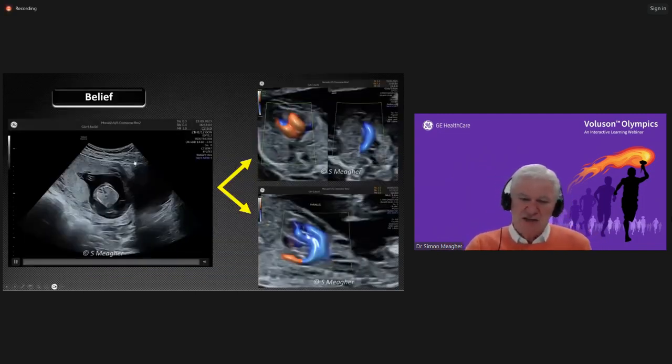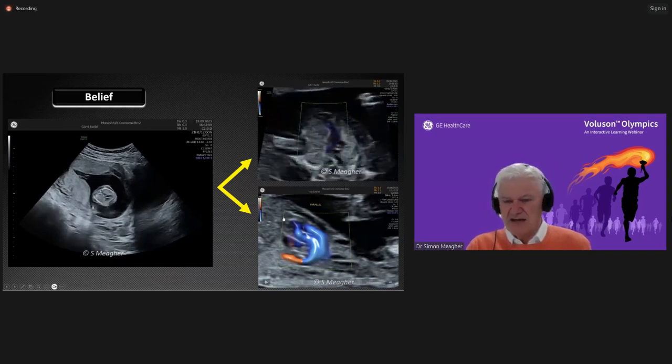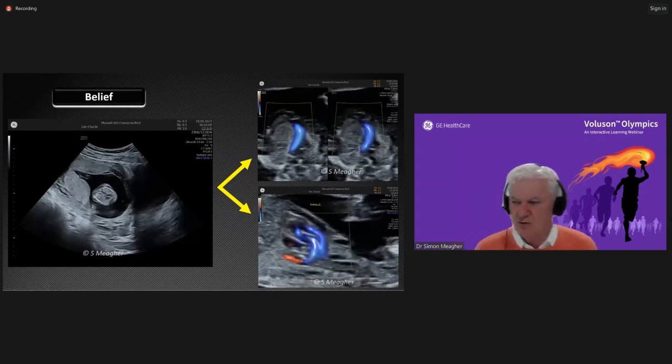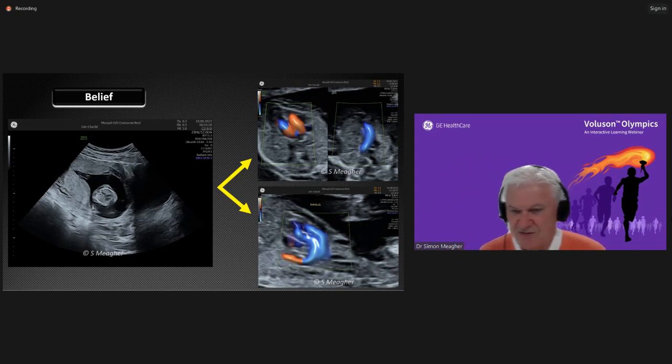So this is where we started. We started with an absolutely lousy image in a baby in a terrible position, and we ended up with a split image showing a 4-chamber view of the heart and a 3-vessel tracheal view, and then we went to a 5-chamber view, just slightly oblique on the arches, and we have findings typical of TGA. And that was over 5 minutes of scan time in making that diagnosis of simple transposition of the great arteries in a patient who was 13 weeks and 5 days.